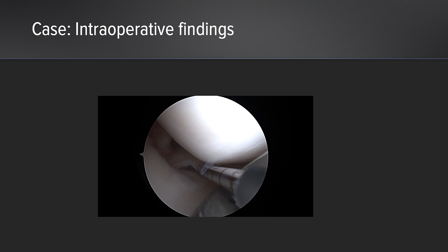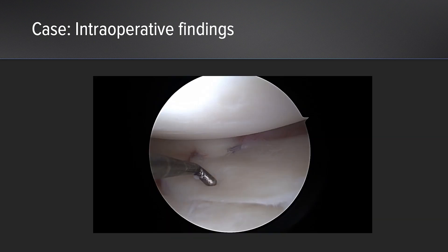This is repaired with two meniscus cinch 2 implants in a vertical mattress fashion, giving us a stable construct as you can see here.